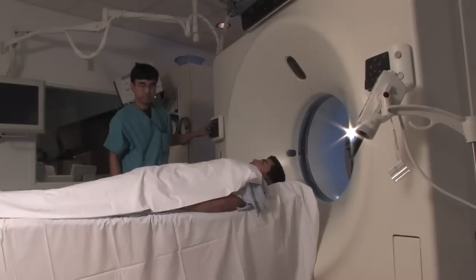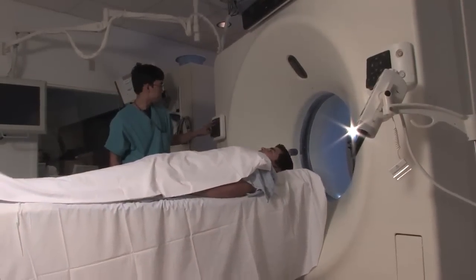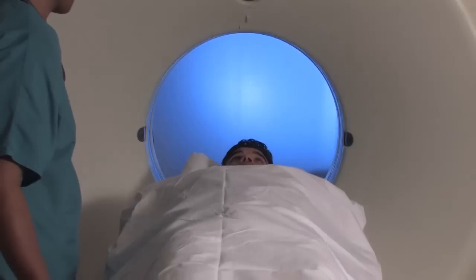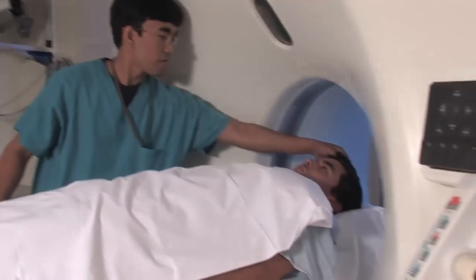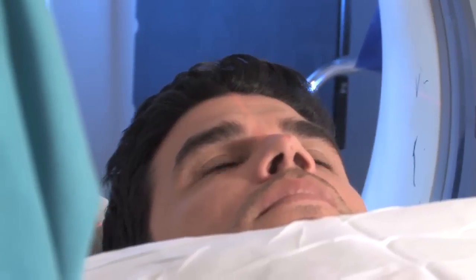CAT scans measure density. If you have something in, for example, the liver, the CAT scan detects changes in the body's structure — such as the size, shape, and exact location of an abnormal growth.